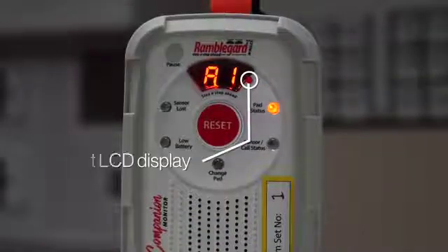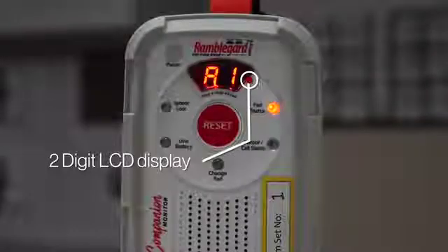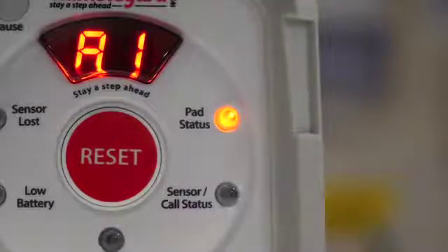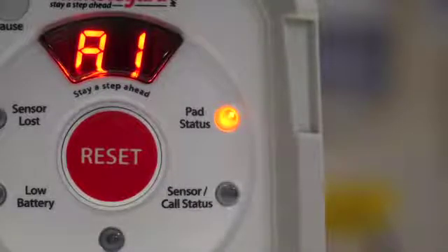The companion has a two-digit LCD display. All alarms are clearly visible on the LCD display and can be audible. It is also used for programming the companion.